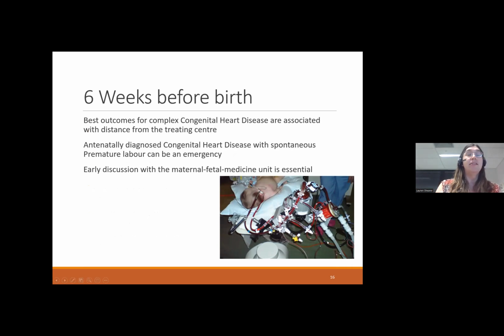And this, for instance, is an extracorporeal membrane oxygenation circuit. And so some of our patients will need extracorporeal life support within the first minutes after birth so that we can get some essential interventions done immediately and stabilise them so that we can get a later surgical repair.